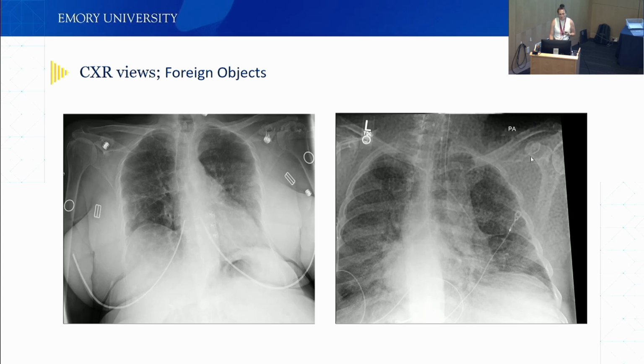It's easy to spot that it's something weird because it's everywhere, also outside of the body. So you know it's probably not a patient-related thing, but it messes up the structure of your x-rays pretty badly. So this does weird things when you try to predict things.